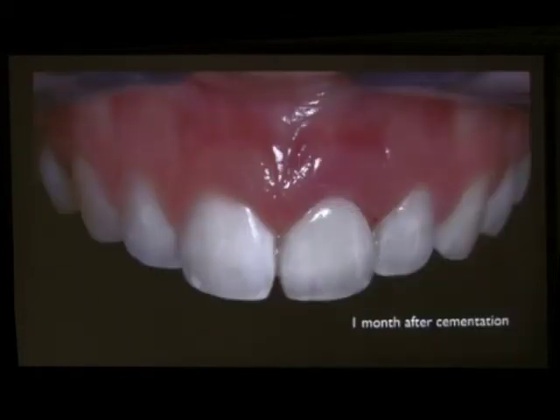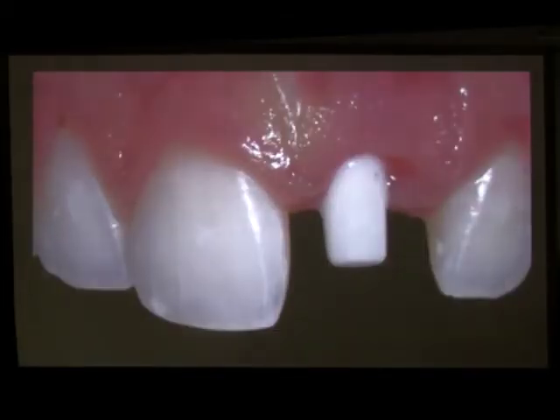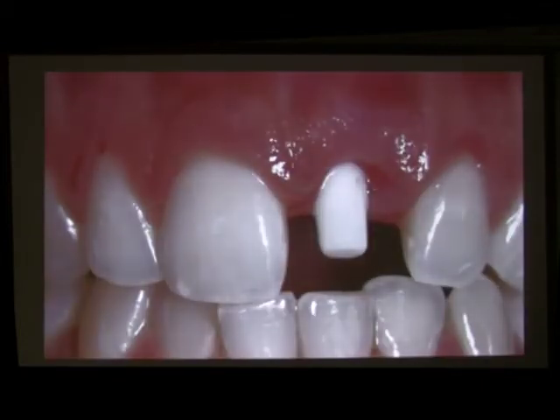I didn't remember to tell you. If the patient comes like this and we didn't take impressions, we cannot use retraction cord. If we use retraction cord, we are doing huge damage, because when the gum has creeped down like this, and you put the cord and try to go deeper than the shoulder level, you are creating damage, and you feel it, because when you are pushing, you are creating damage. So we don't want to do this.